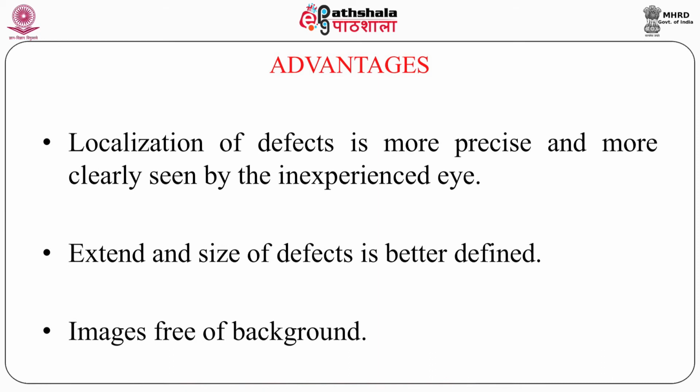And the extent and size of the defect are better defined, because if you are able to see the image and resolve it, you can say that this is the place where the disease is, and doctors can decide the future course of action.